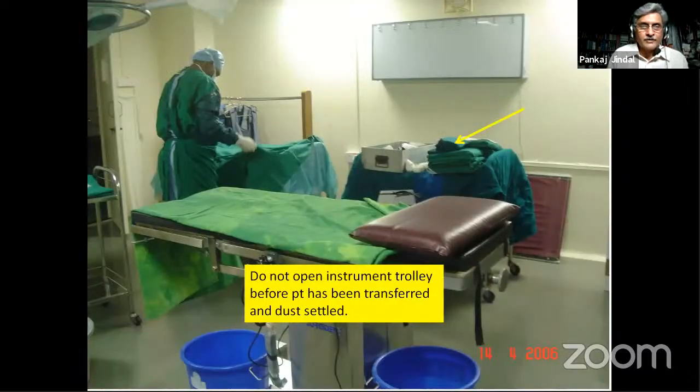Let's talk about the infection. The one that is absolutely avoidable is opening up the instruments and everything before the patient is wheeled in here. Once the patient comes, he shifts to the trolley, all the dust that percolates into the room settles on these instruments, and therefore these should not be opened. At least that's the protocol that we follow.